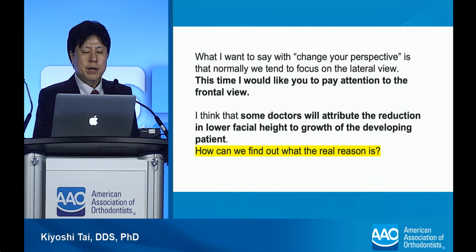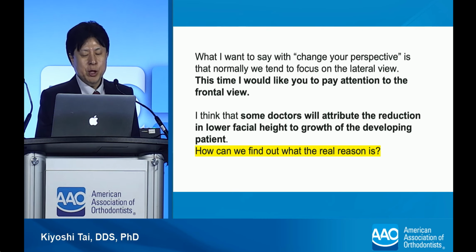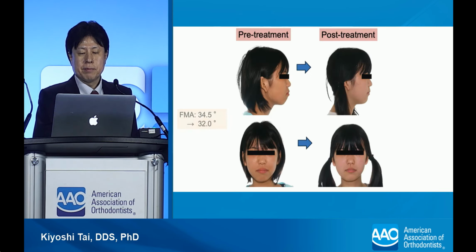What I want to say with the change of perspective is that normally we tend to focus on the lateral view. This time, I would like you to pay attention to the frontal view. I think some doctors will attribute this phenomenon to the growth of the developing patient. How can we find out what the real reason is?